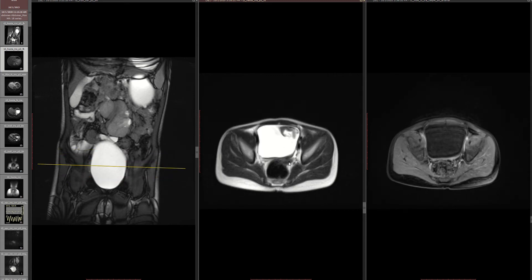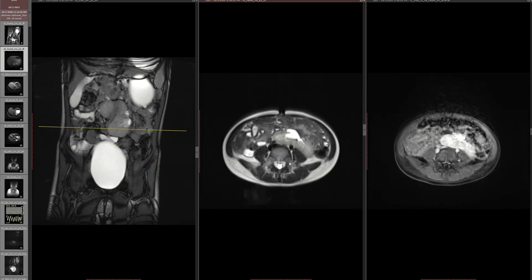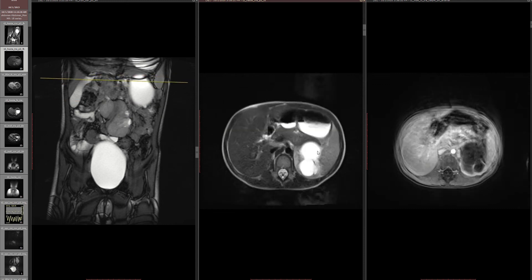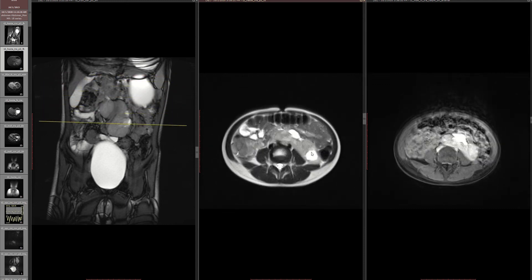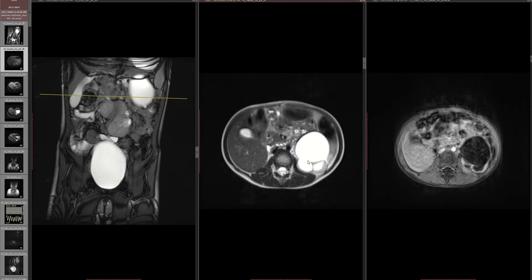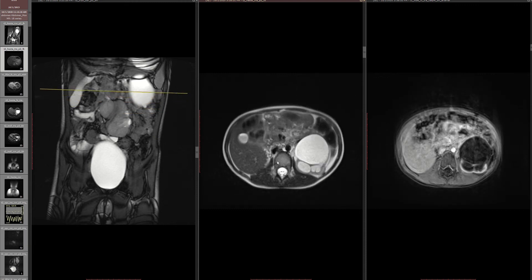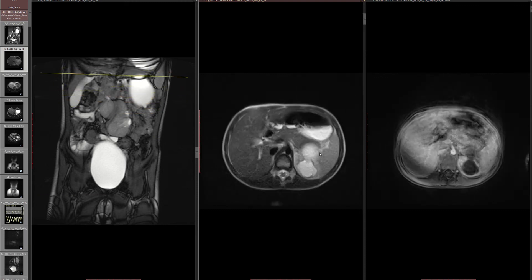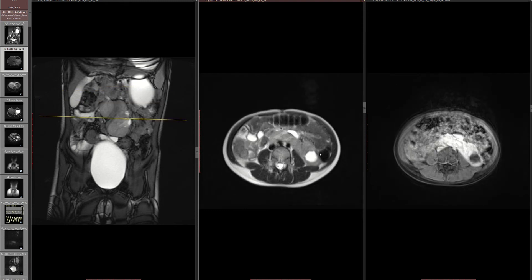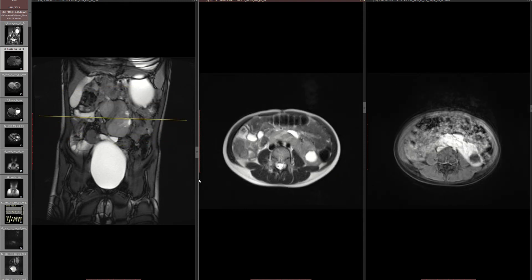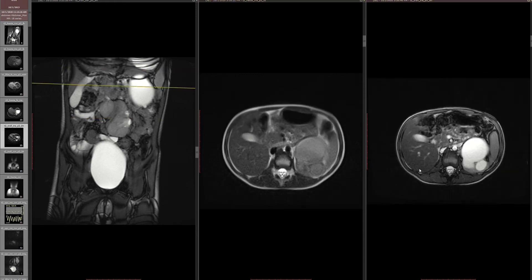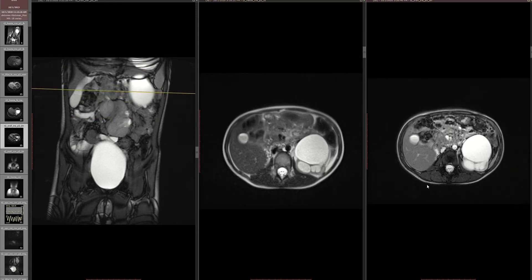There is no ureterocele or anything. Unfortunately, I am not able to see any ureter continuing from the left side moiety — I'm not really seeing any ureter or anything going out from there.